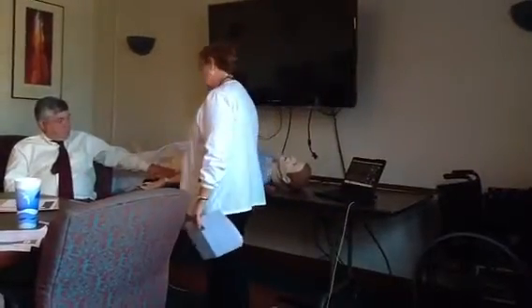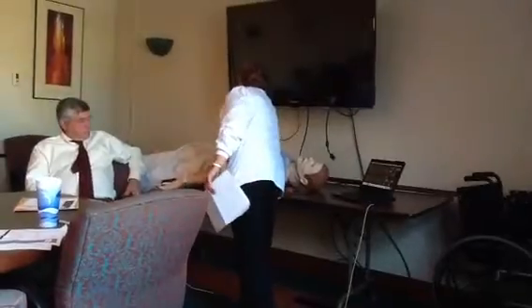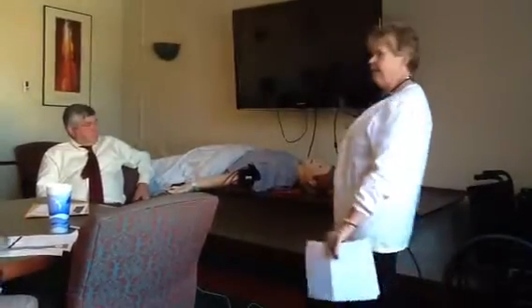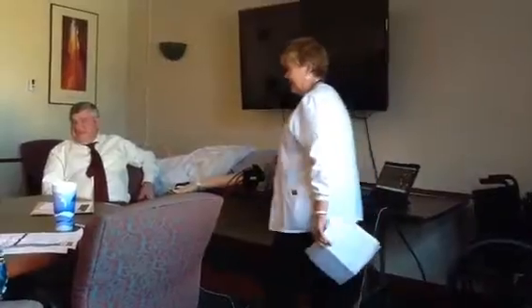Can you feel it? He's got good pulses, actually. He has veins that you can poke. We can fill him with, so we can silence the alarm just like in real life.